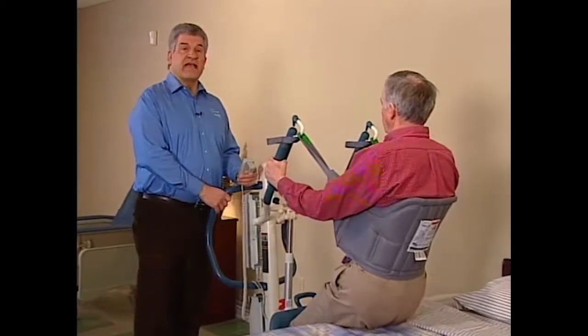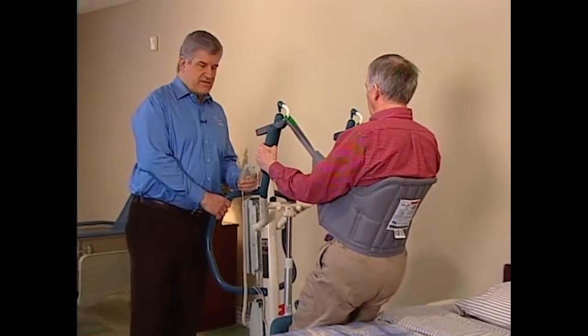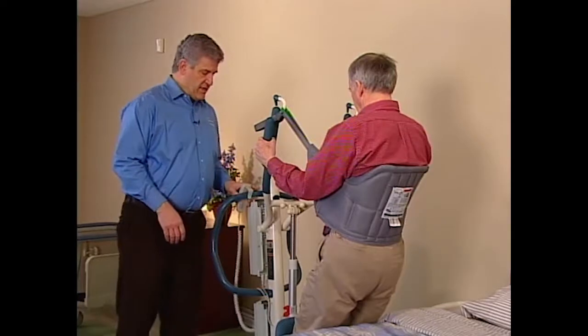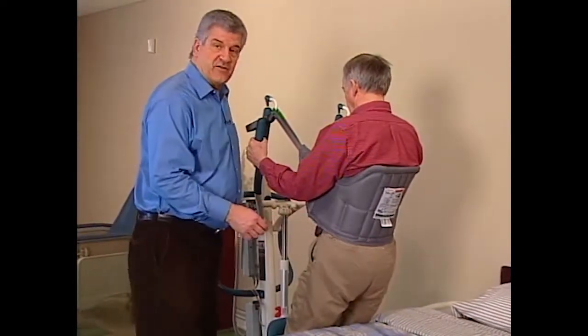Invacare Standing Slings and Stand Assist Slings are designed to work with Invacare Stand Up Lifts. They're designed for residents who can support the majority of their own weight in a standing position. These slings allow full access for quick toileting and everyday transfers.